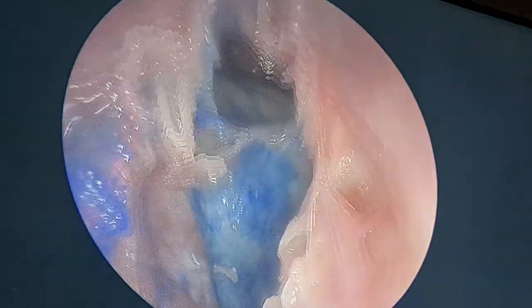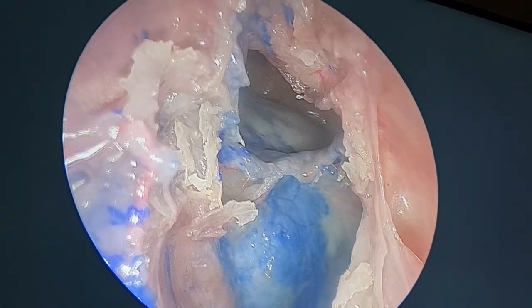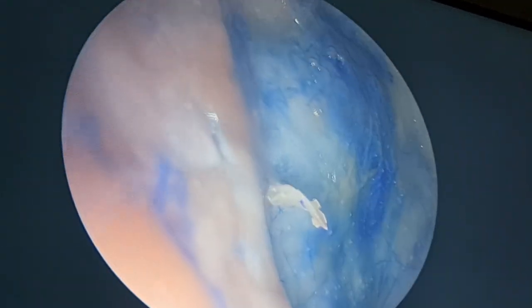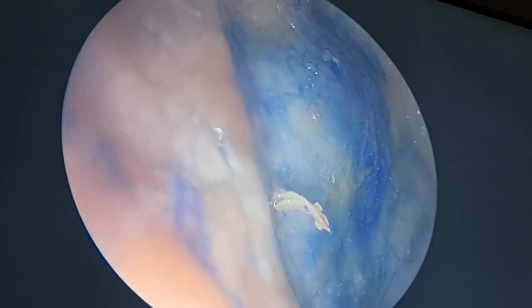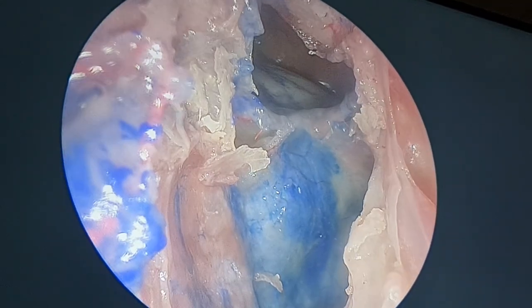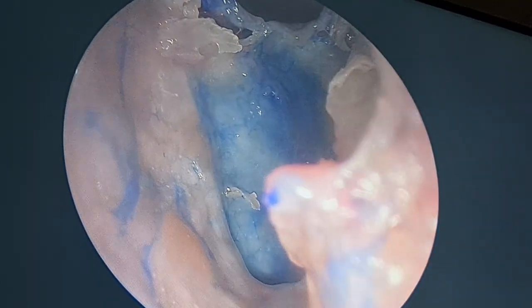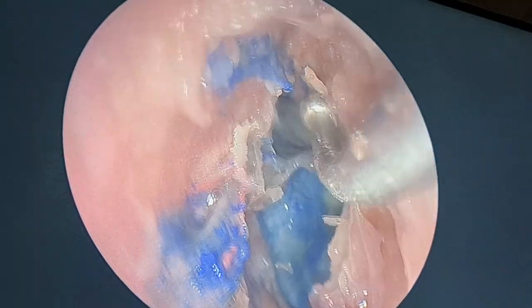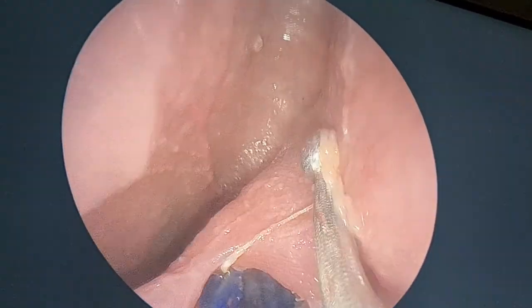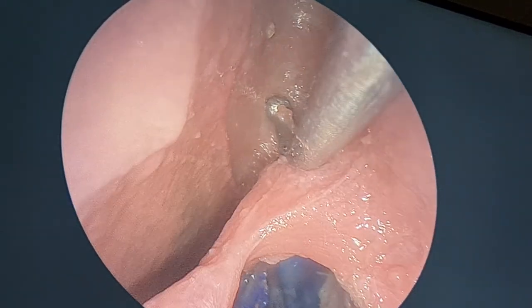Now, this frontal sinus. For regular sinus surgery, you need to adequately widen it without doing anything inside. You can suck out, you can flush inside, but for inflammatory disease you don't need to do anything inside the frontal sinus. But for the extended indications, you can't work beyond from here, because the obstacle is this deep. So Draf has devised various procedures, which I am going to show you once the sinus surgery completes, which make your frontal sinus surgery so simple.